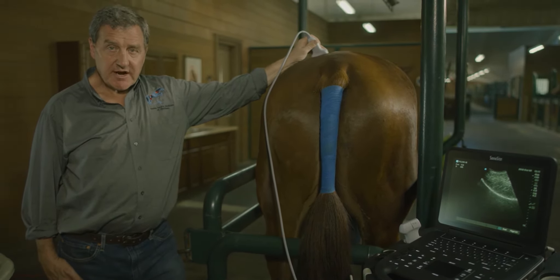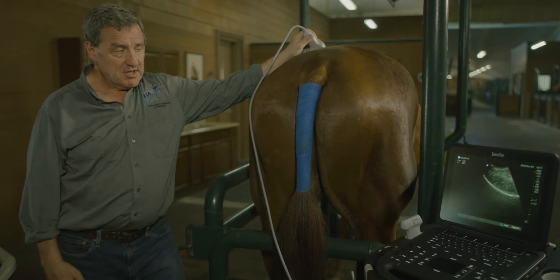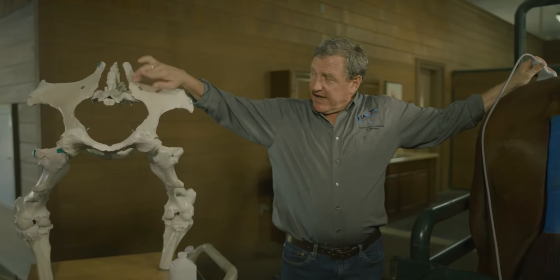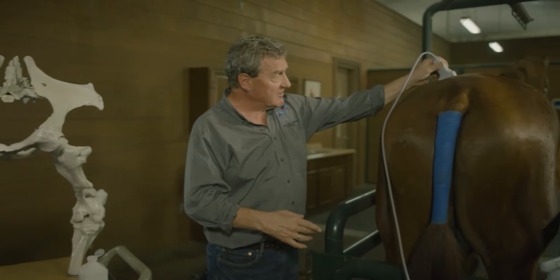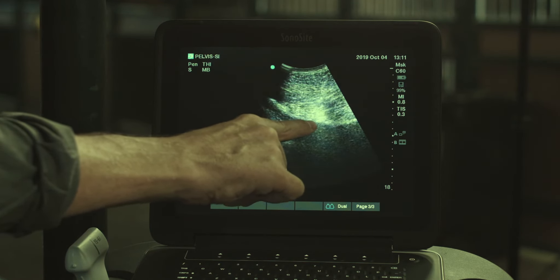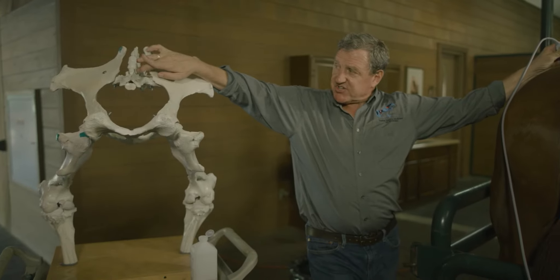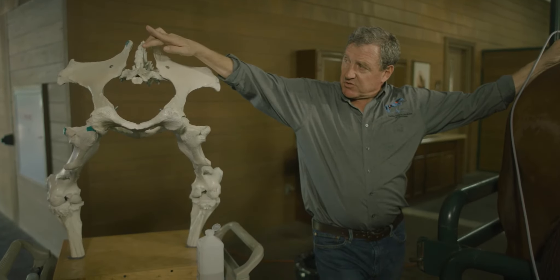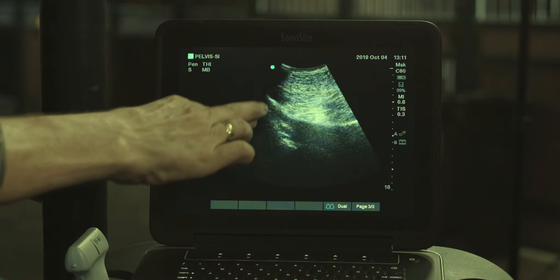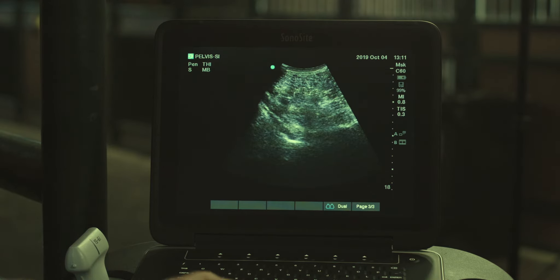Initially we looked at the external landmarks for ultrasound guided injections, and now I want to show the sonographic landmarks on the screen. Here you see the curved image of the caudal aspect of the ilium wing. I'm going to rock my transducer — not slide it or move it any other way — and as I rock it you can see the ilium walking virtually across the screen. The J-shape of the sacrum shows up here, and remember that dorsal membranous portion of the sacroiliac ligament comes down from the apex to the lateral shelf. As I move down you can see that thin line — that's the membranous portion of the dorsal sacroiliac ligament.